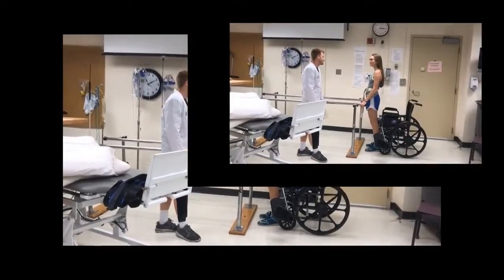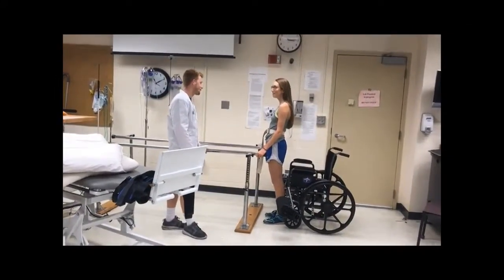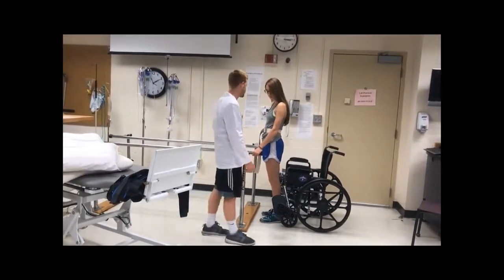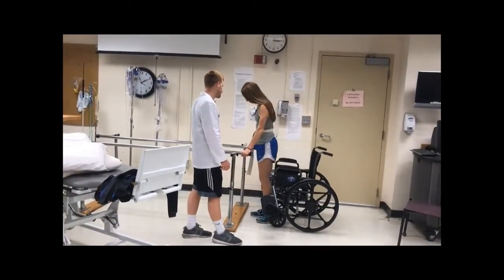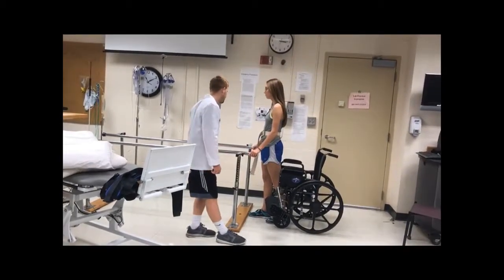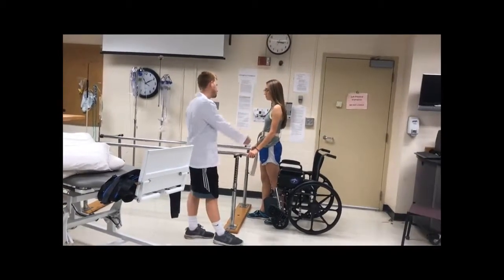Joanna, those are some interesting exercises we got done today. So now what we're going to do is we're going to sit you back into your chair. What I'm first going to have you do is put your foot against the chair so you feel it. Then you're going to reach back with one arm, and then as you're sitting, reach back with the other, and then you're going to sit. I'll help you.